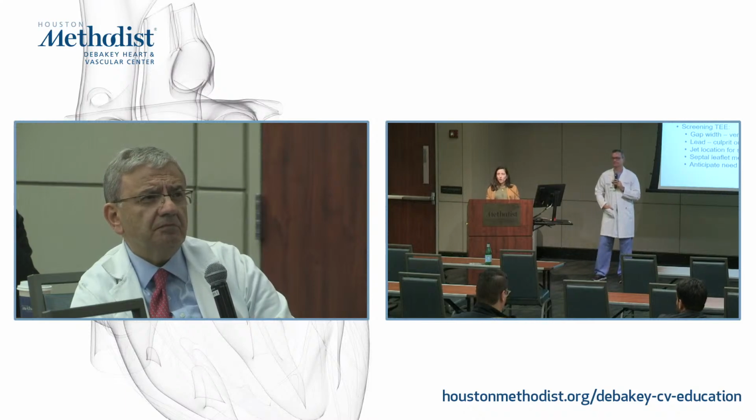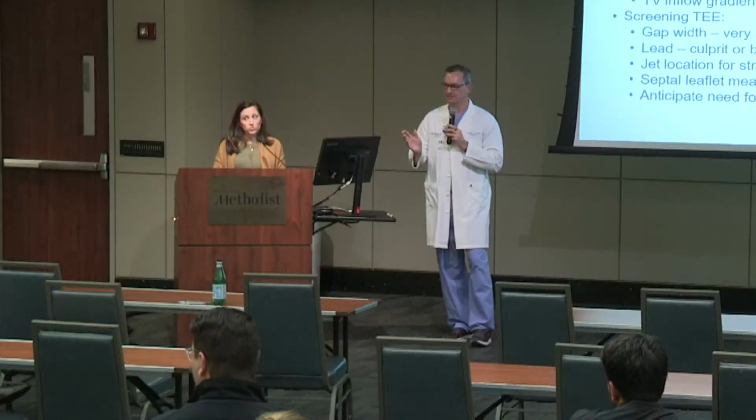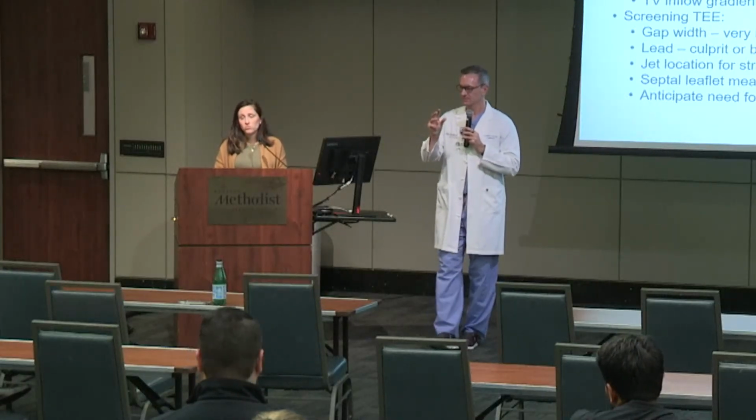Yeah. But still, I think it's not only the cost issue. Everything that Dr. Little said is very tomographic, and with the TEE, you can see a more comprehensive picture, and I think we can easily get to the views that we want. So mostly for grasping, we've been using it. It's akin to trying to do a complex TEE only with the zoom mode. That would be a little frustrating.